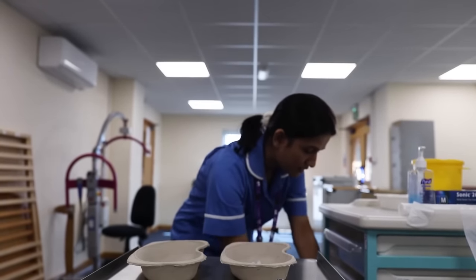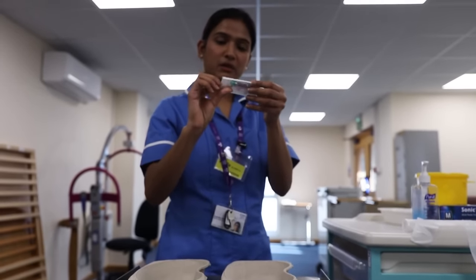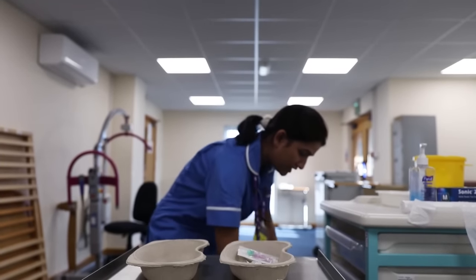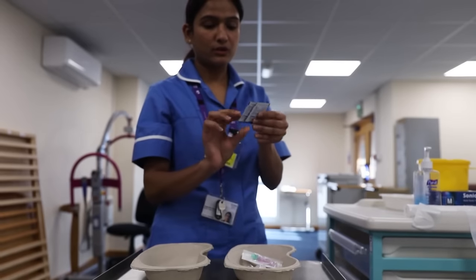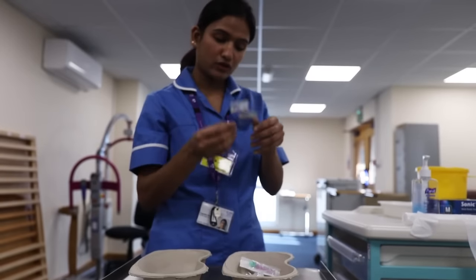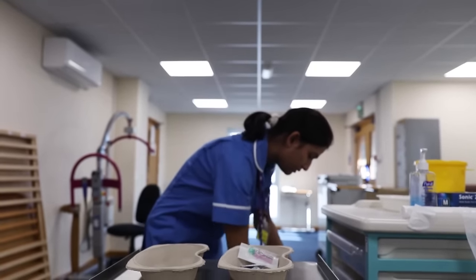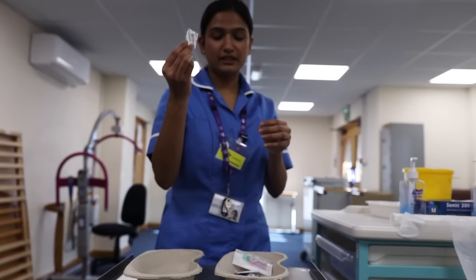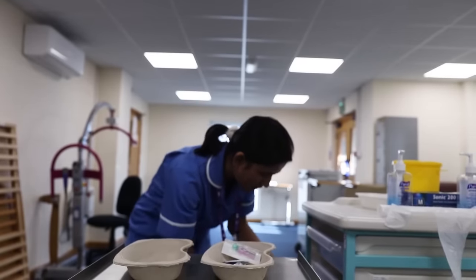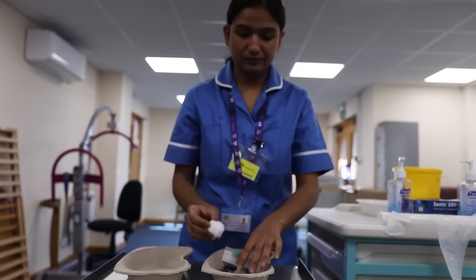I will also need 1 injecting needle. It is intact and the expiry is in the year of 2025. I need 2 sterile swabs, alcohol swabs, and these are intact. The expiry is in the year of 2022. I need 1 plaster, it is intact in case it bleeds, and I will also require 1 clean cotton swab.